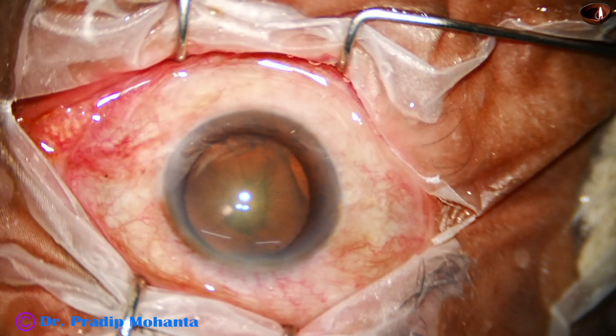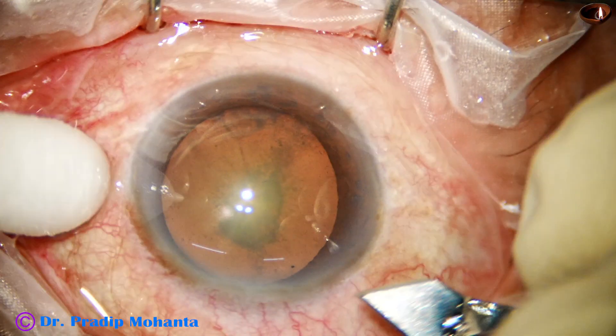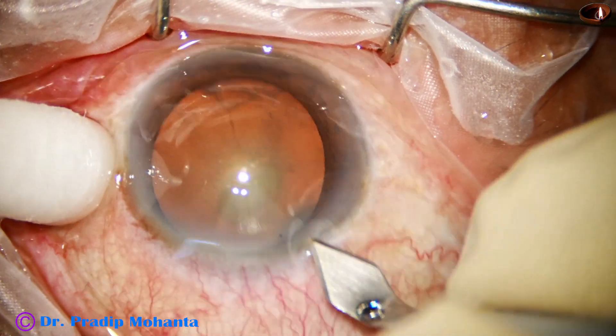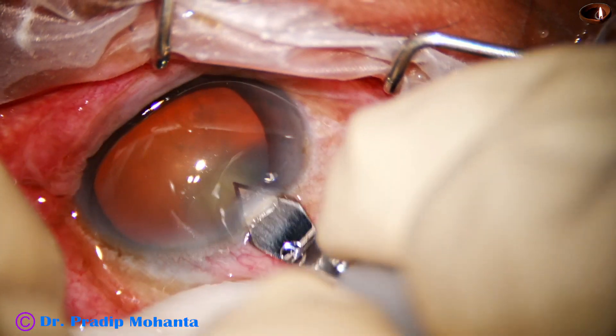I usually do the main incision first and then the side ports — you can do the reverse, making the side port first and then the main incision. Here goes the main incision. This is a 2.8 mm keratome. The incision is made on the posterior aspect of the limbus.